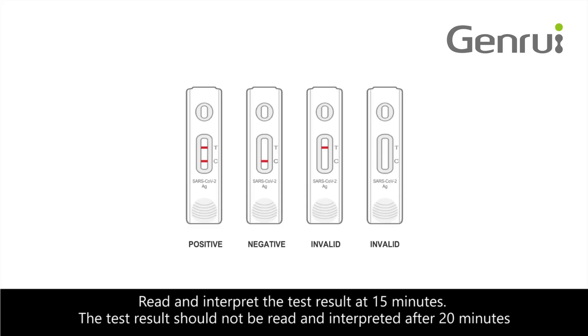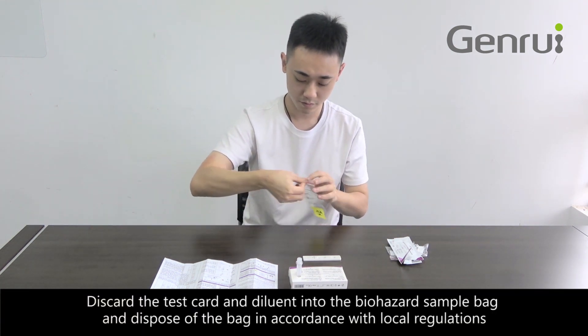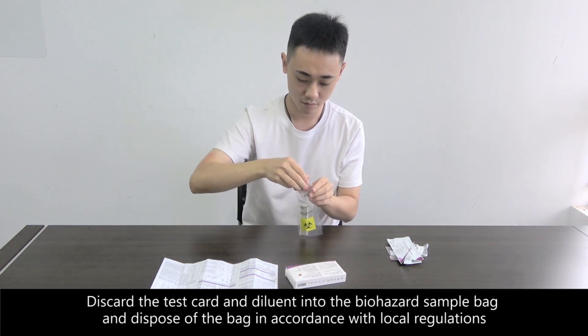Read and interpret the test result at 15 minutes. The test result should not be read and interpreted after 20 minutes. Discard the test card and diluent into the biohazard sample bag and dispose of the bag in accordance with local regulations.